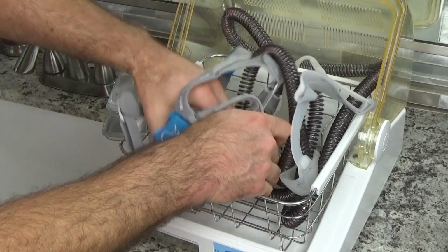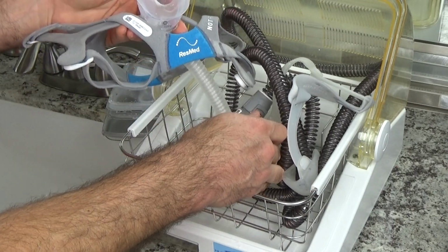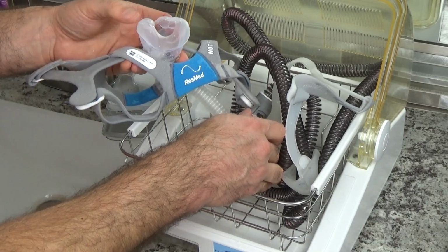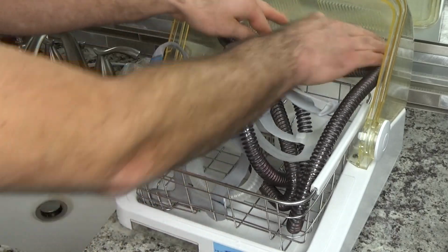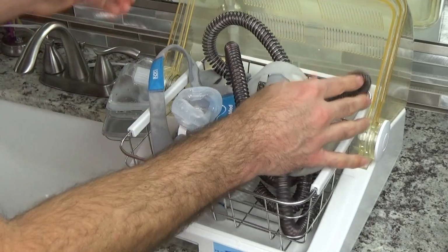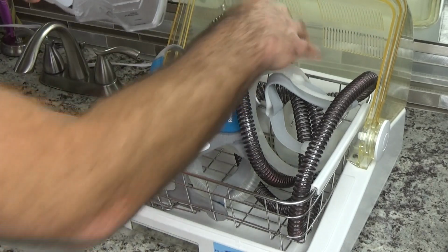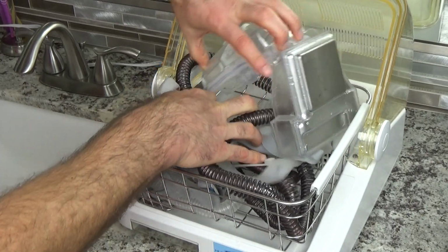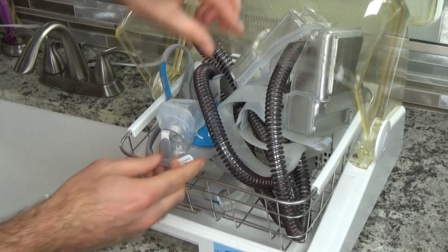Now I usually put the cushion side face up because everything is going to run down into the tube and that way it prevents water spots from getting on the actual cushion, but really not a big deal. And the last thing is the humidification chamber. I'm just going to open it up and also set it in here. There, now we have a bunch of crap in there. We're just going to go ahead and close the lid.